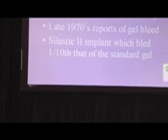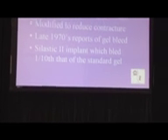use again. The silicone implants were first done in the late 60s and 70s. There was a report of the gel bleed, and it is said that the chance of them leaking is 100% with time.